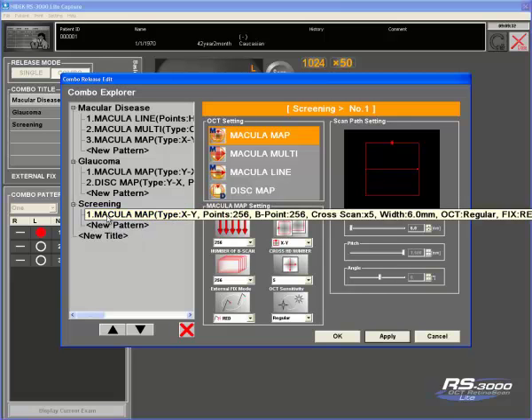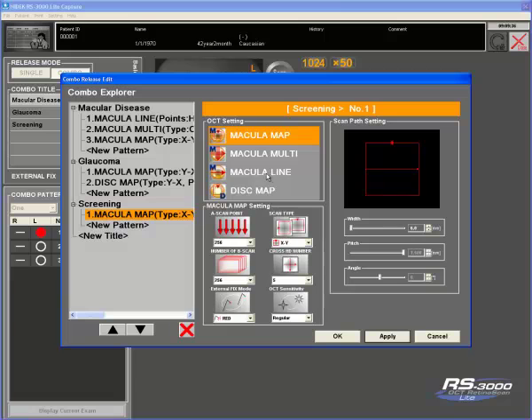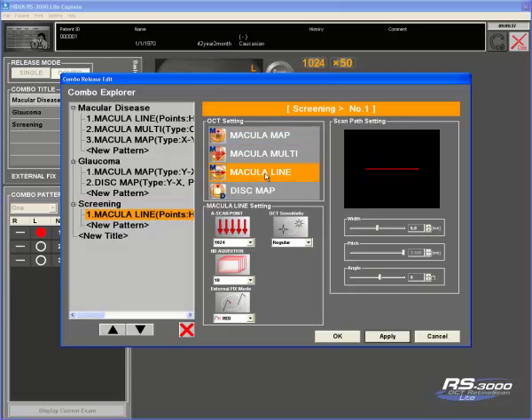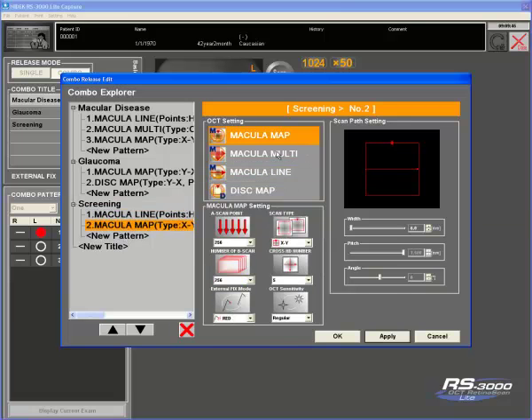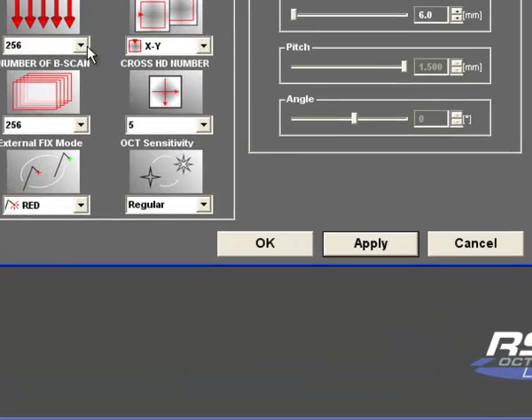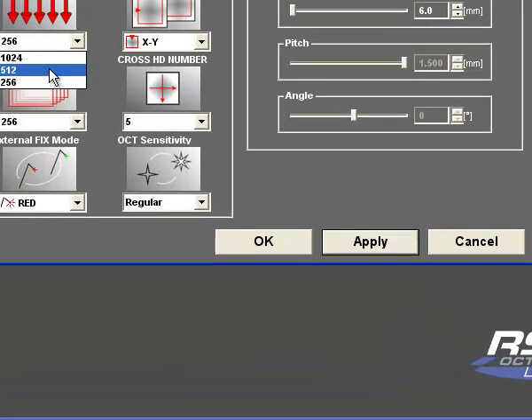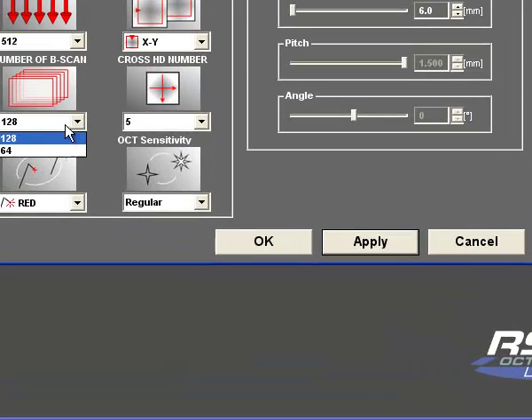It will then present you with a list of map options. The first scan I might want to do may be a macula line. I want a nice high definition macula line, so I am going to up the settings as high as possible. The next pattern will be a macula map, again setting the settings I want.